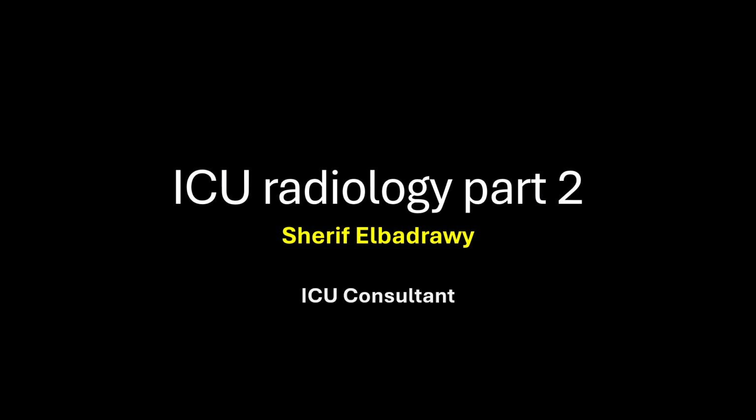Today we are going to discuss the second part of the radiology series, and today is about how to differentiate between airspace disease and interstitial lung disease on the chest X-ray.